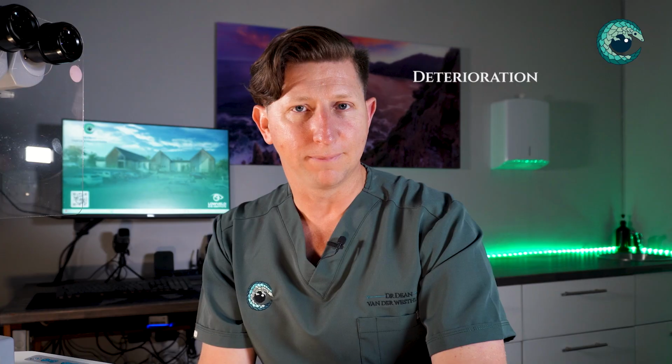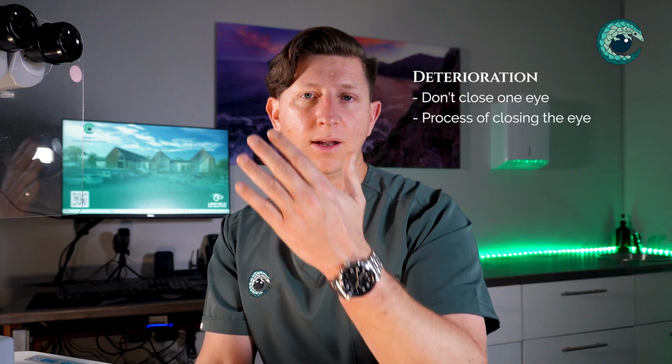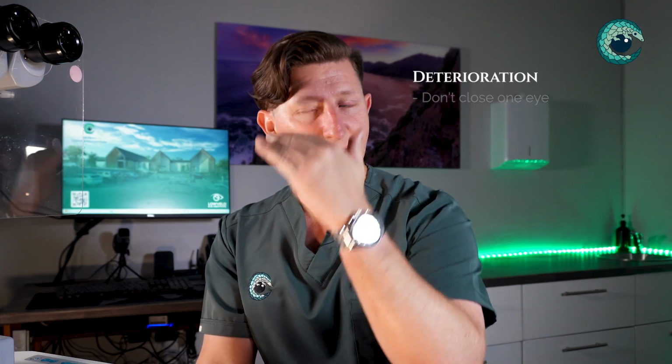But in the interim, it's often good for the patient to have some way of noticing whether there's some deterioration. Often patients don't close one eye, so the process of closing one eye and then the other forces you to assess that eye. Often one eye can deteriorate, can get much worse, and patients haven't even noticed until they come for their follow-up. And maybe we could have intervened earlier or done something sooner.